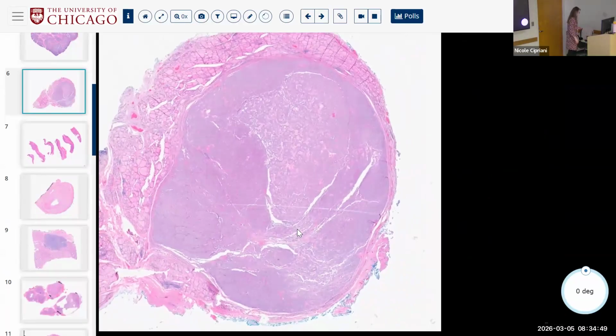Overtly benign or overtly malignant? Or don't know yet. Based on? So solid. I see it has left normal architecture centrally. But I suppose it doesn't really look exactly like a follicular or papillary pattern right now. Yeah. So I'm not seeing maybe normal structures that are just adenomatous. Okay. But I mean, it could be maybe benign.